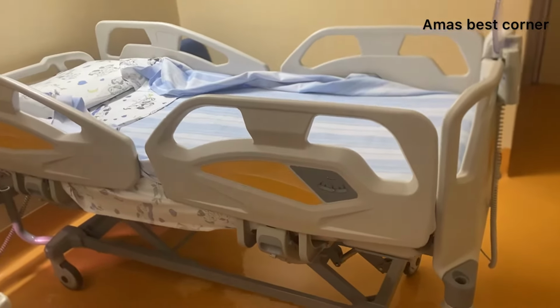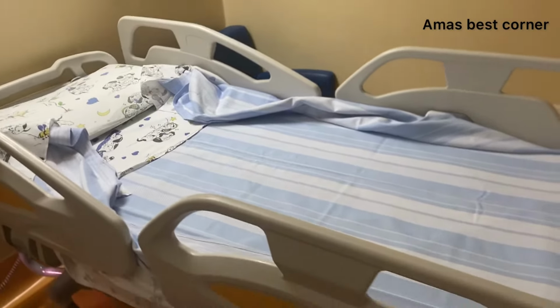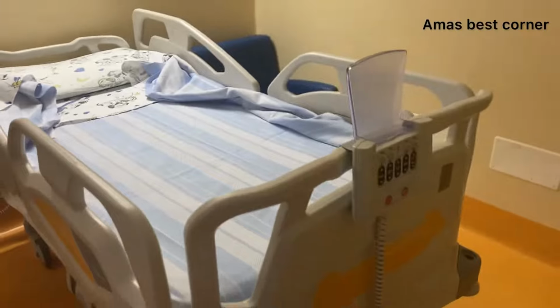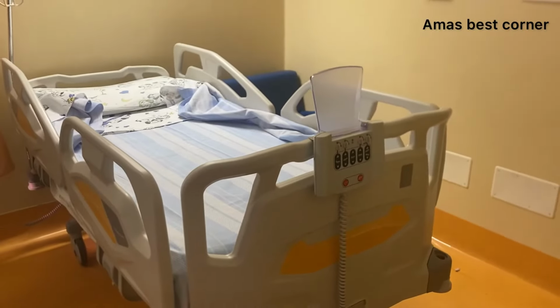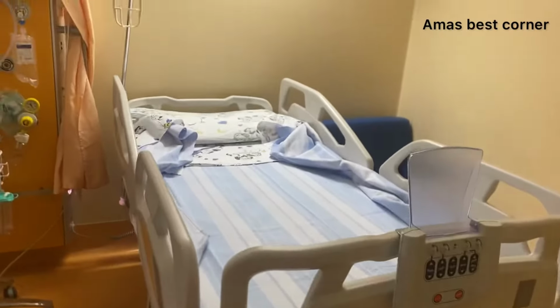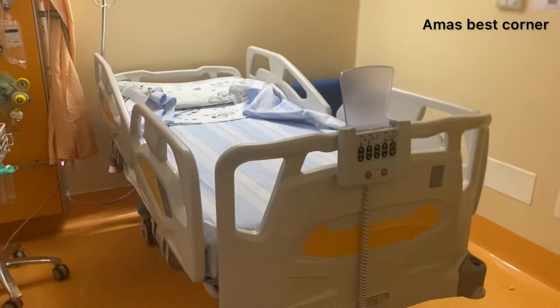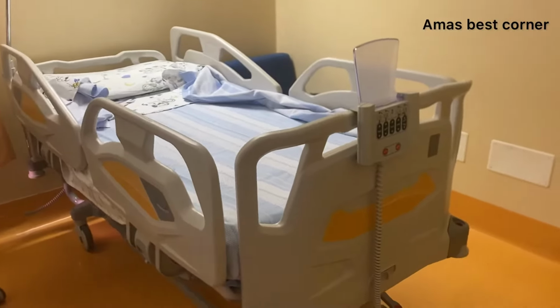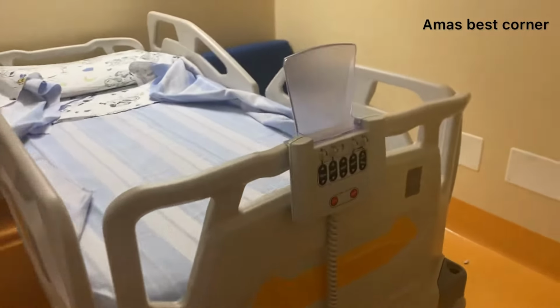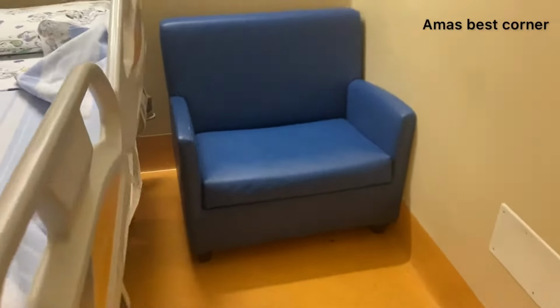In today's video, we're going to be taking a tour of an Italian hospital room, how it generally looks like. So this is the bed in an Italian hospital. It has something like a remote control here. This place you can control the bed. If you want to make it high, low, anyhow you want it, you can use this button here to control the bed. Some of them have the remote on the side of the bed, but this one has its own in the front. So this is the chair.